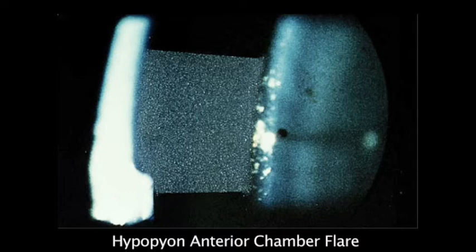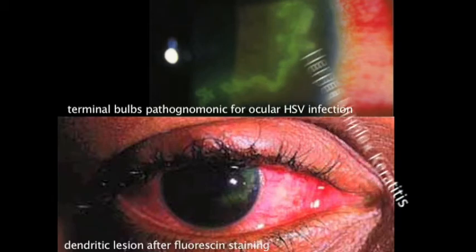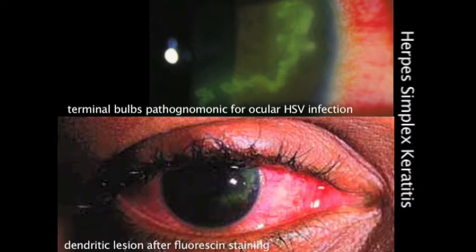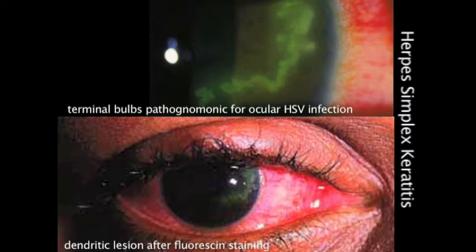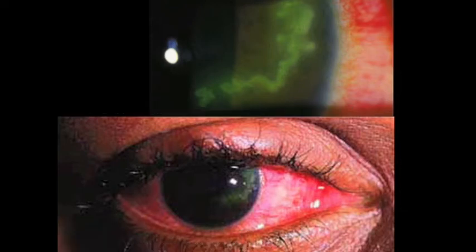Keep your slit beam at an angle, shorten the beam to 1 mm, and narrow it to approximately 1 mm, and turn up the lamp voltage. Focus on the anterior space. This finding should look something like the light beam of a movie projector shining in a dusty room. This is a dendritic ulcer in a patient with herpes keratitis. The detection of this finding is aided by the use of fluorescein staining. Often, patients will not present with the severe pain found with corneal abrasions, despite the sometimes large area of fluorescein uptake. If a patient presents with irritation or foreign body sensation but has extensive stain uptake, suspect a herpes infection.